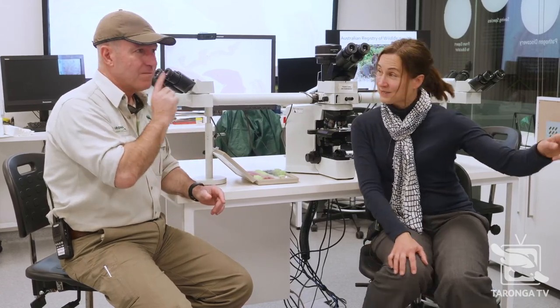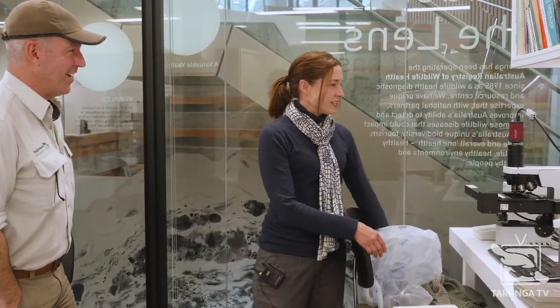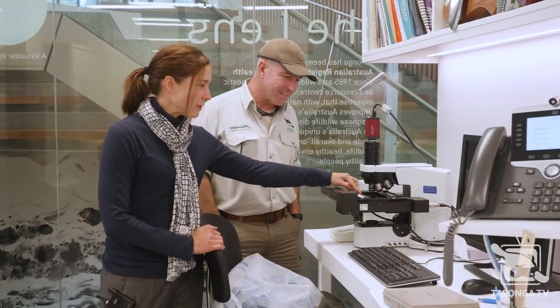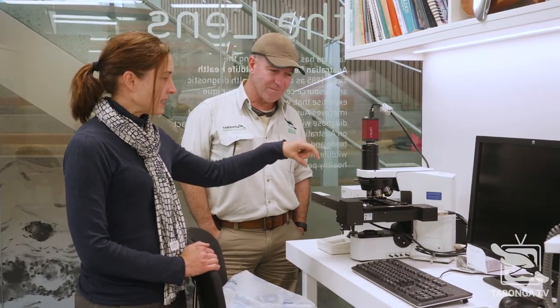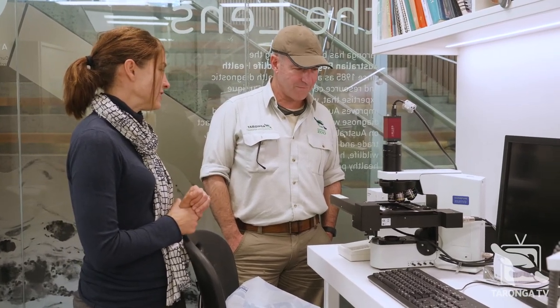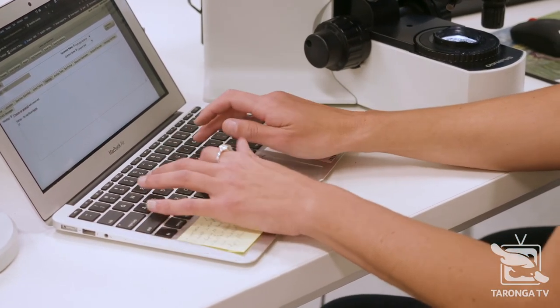Now, can I show you this microscope? Please. This is my pride and joy. Wow. So this is a microscope that scans. We can put a glass slide on here. It's got a motorized stage. It will scan the microscopic image at multiple different planes so that we can take it onto a computer and share it again around the world. Anybody can use their computer like a microscope and focus up and down through it, put little notes and highlights on the image, again for research and education. It's a beautiful thing.